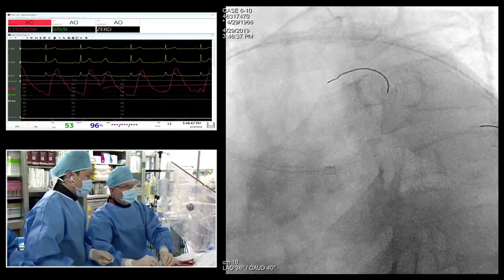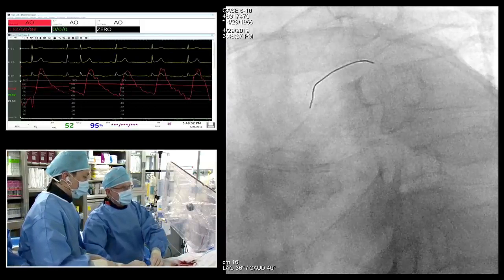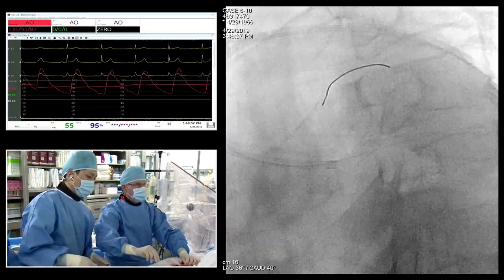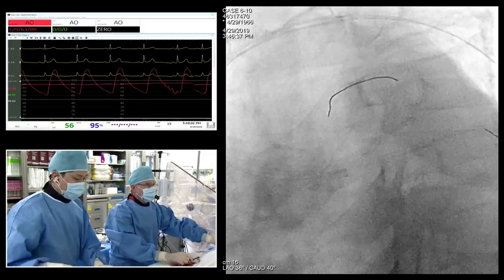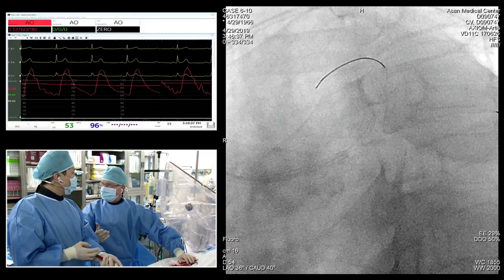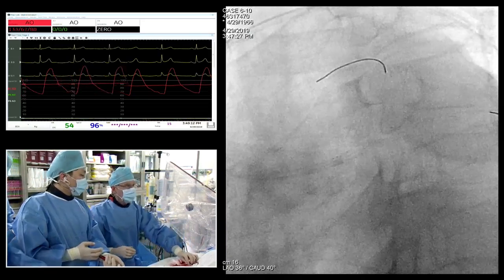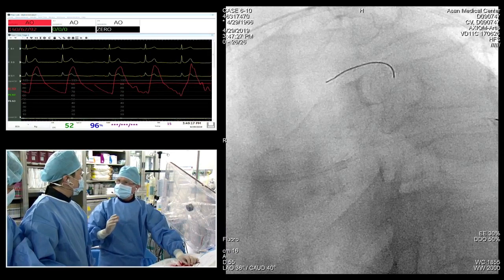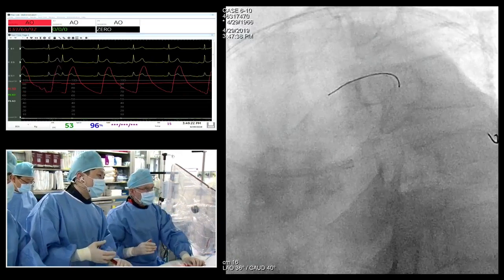We're going to do maybe an inflation with a 4-0 approximately, and then we're going to do an IVUS. I'm going to do the IVUS at the end after the 4-0, because I know that if I do it now, I'm going to have malapposition. Maybe with the kissing we did some improvement, but a short 4-0 will be okay. Maybe after the 4-0, we may have to do another kissing just for the aesthetic, because the circ is going to still deteriorate a little bit.